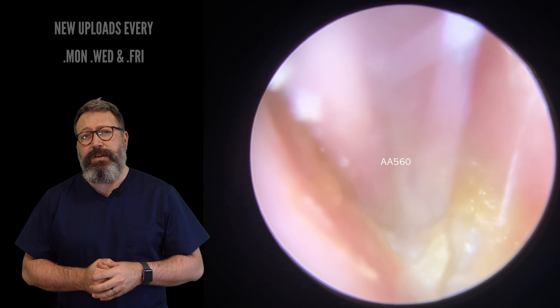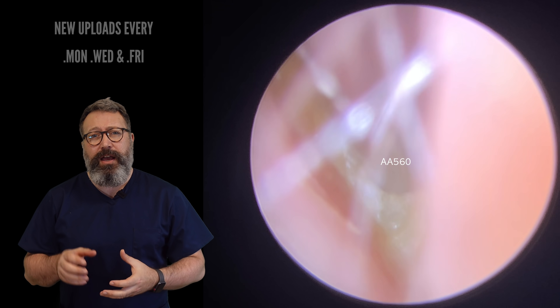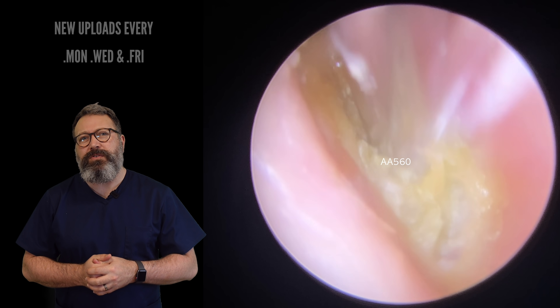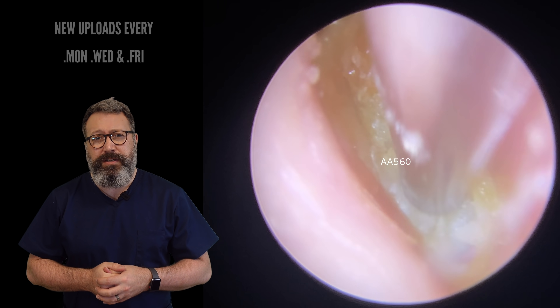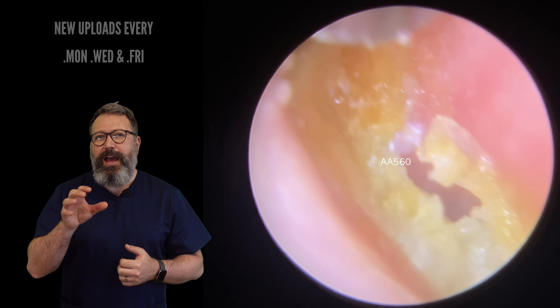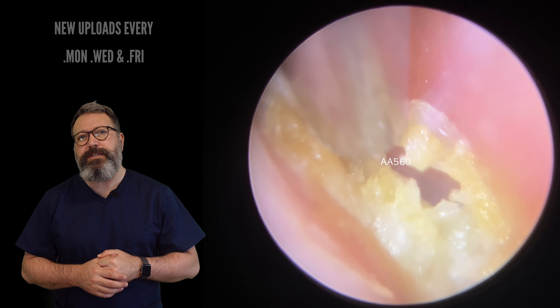Now this lovely patient's come through. You can see this very light cream-coloured material here sitting quite deep in the ear canal. This patient has had quite a few surgeries on their ears over the years, has very poor hearing on this side and does wear a hearing aid, but has to come in roughly every 8 to 10 weeks to have this removed.